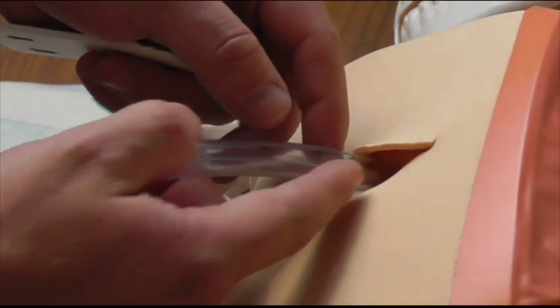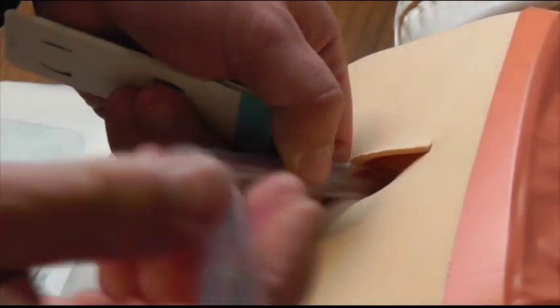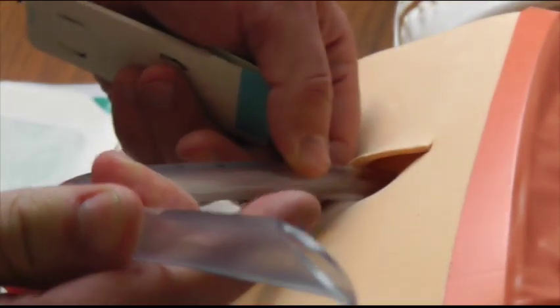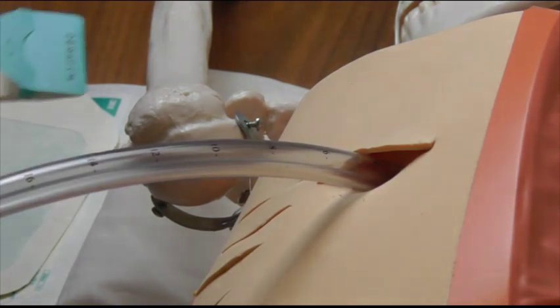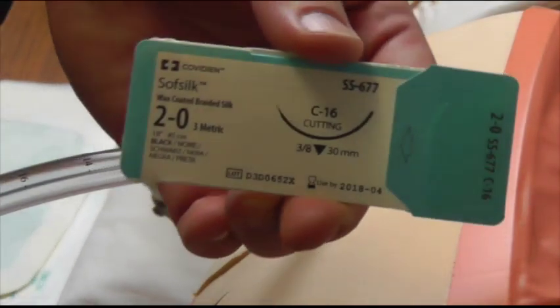You've got your tube in the patient, it's up to a lot of depth, all the holes are in the patient, you've connected the end up to your drain, you know it's swinging and bubbling. The first thing you're going to need is some sort of thick suture material.